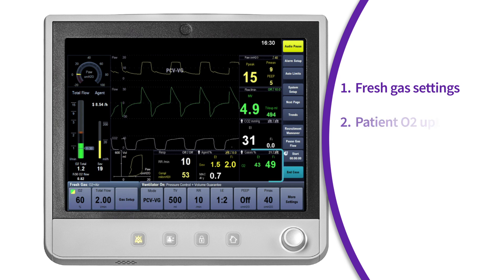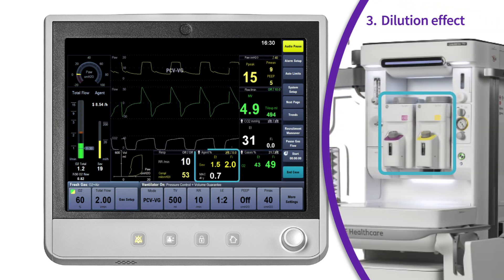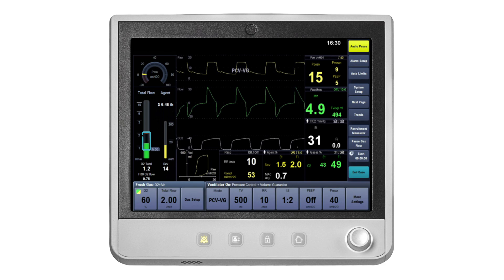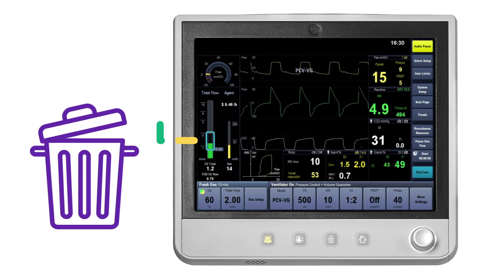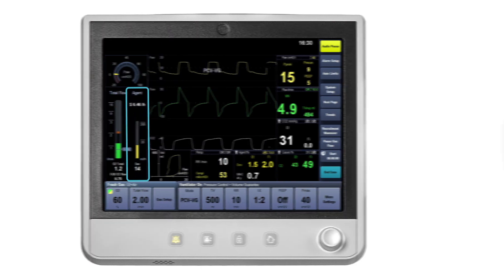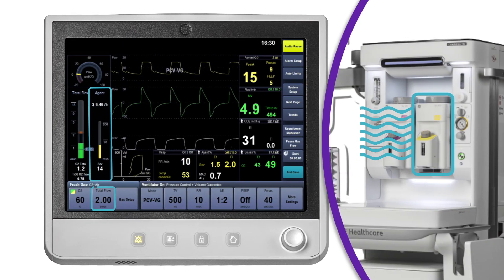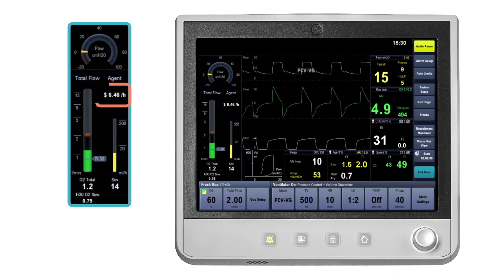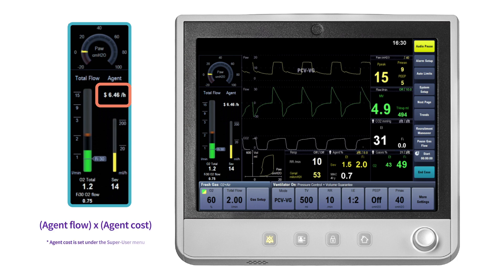The FiO2 total flow value is specific to each patient and each case. This value is calculated using fresh gas settings, the patient's oxygen uptake, the dilution effect of the agent being delivered, and the effects of the circle system. The fresh gas flow showing above the FiO2 marker is considered waste gas and is going out to scavenging. The agent flow indicator shows the amount of liquid agent flow as related to the fresh gas flow setting, in milliliters per hour. There is an optional agent cost value that can be displayed above the agent flow indicator, determined by the agent flow multiplied by the agent cost.